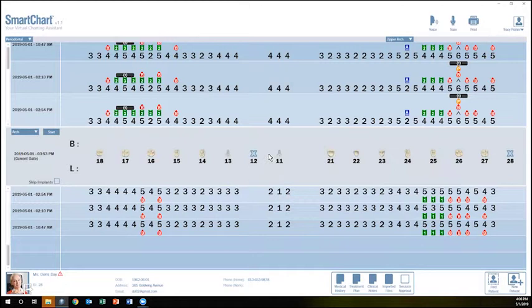It's going to open up her periodontal chart. And as you can see, I've done quite a number of charting measurements on her already today. So you can see that her numbers haven't changed because she is our test client. So let's pretend we are in an operatory setting. I am going to be using my mouse and I'm going to turn on the voice icon on the upper right side of the screen. When I click on that, it is going to be ready for voice commands. It's going to highlight in red. So then I'm going to glove up and I'm going to get started.